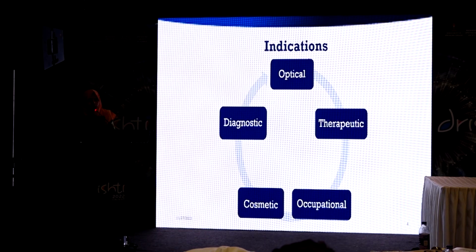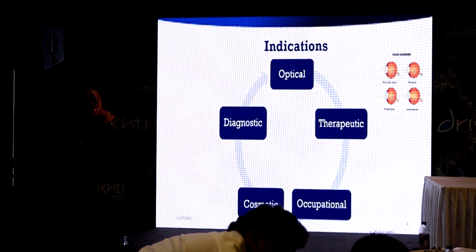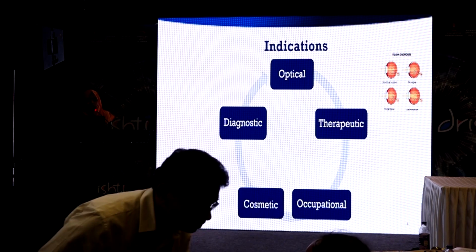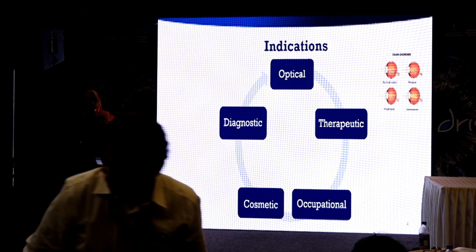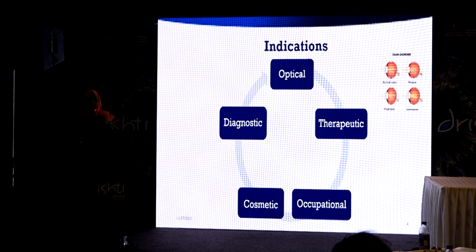Indications, mainly to whom we can give contact lenses. Optical: mainly for the refractive error corrections of myopia, hypermetropia, astigmatism, uniocular aphakia, and also irregular astigmatism and keratoconus.